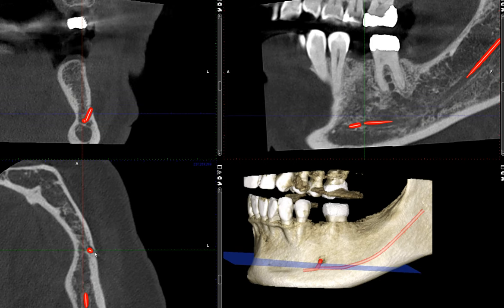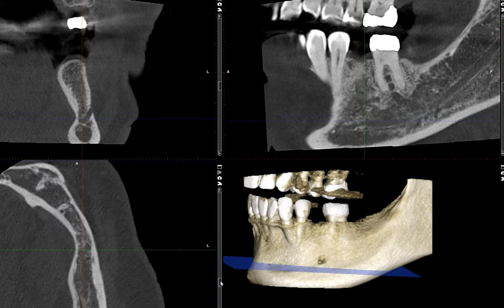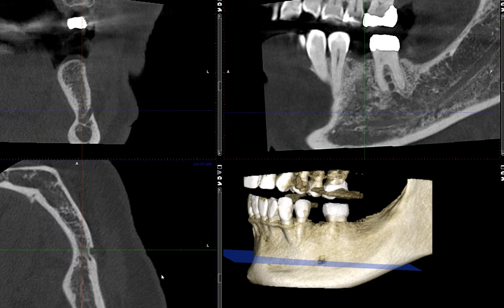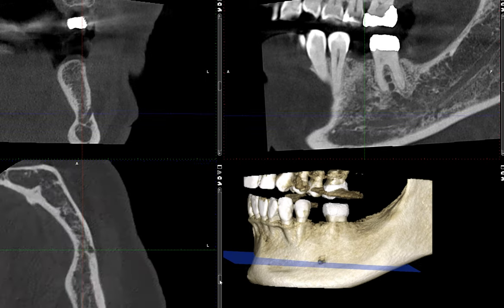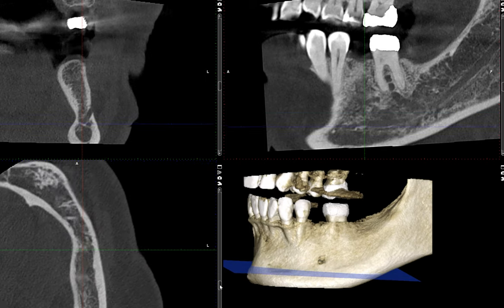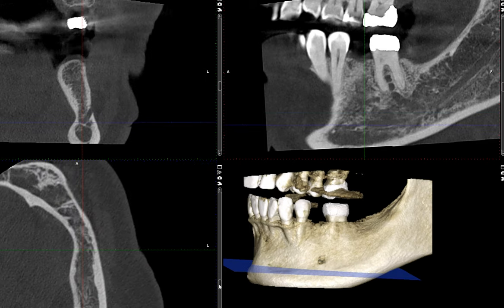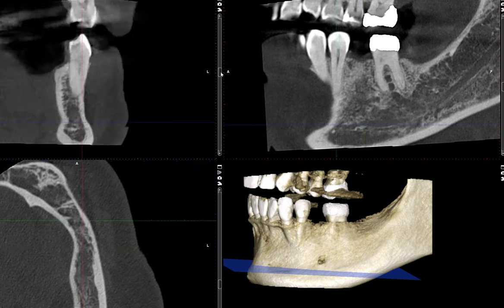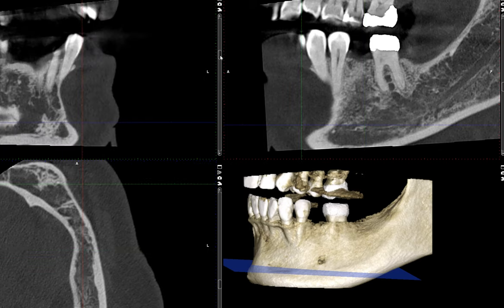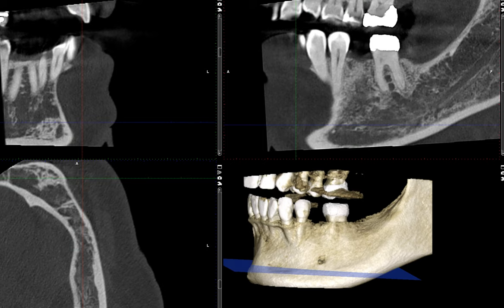And here is the mental foramen. Here is that mental foramen — you can see the nerve. Why don't we look at this in the coronal or cross-sectional view and move it to the anterior.